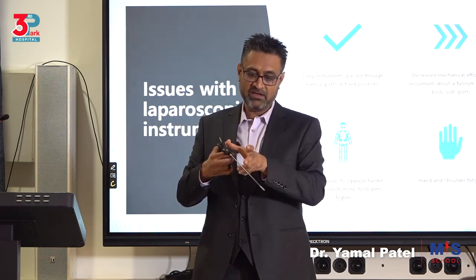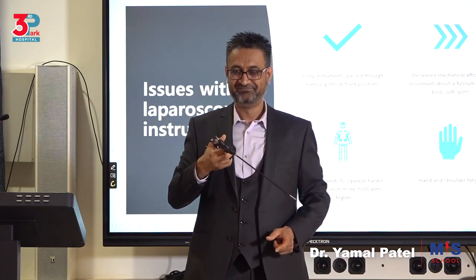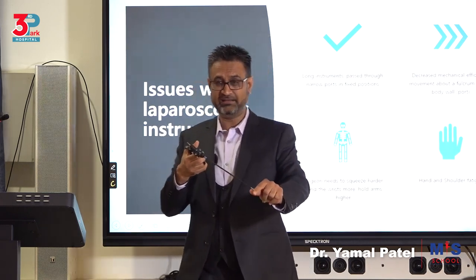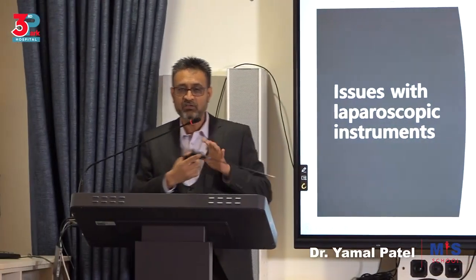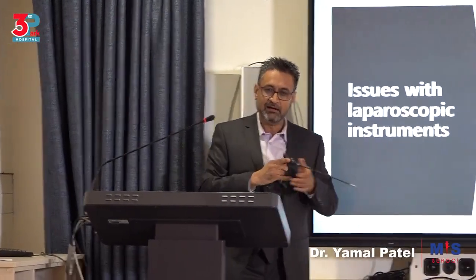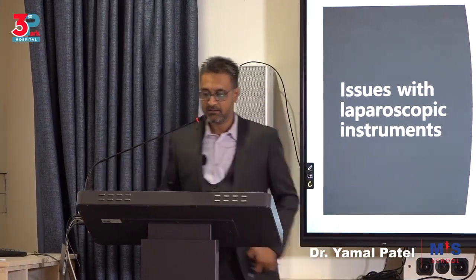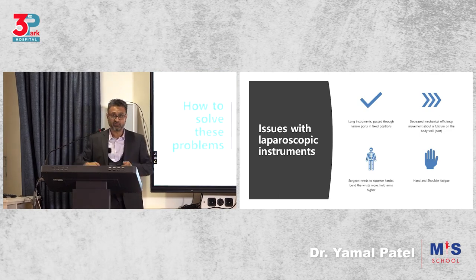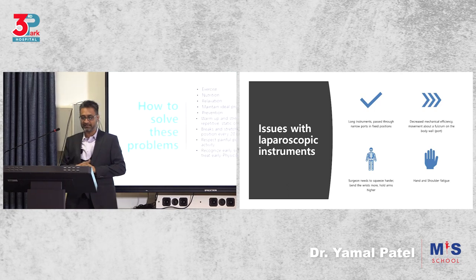In laparoscopy, you'll have to put 3 pressure here to get 1 pressure here. You'll have to put more pressure here to get the same pressure on this. You understanding? So it's not the best scenario. So you have to be careful with how much pressure you put so that you don't injure your hands. Then hand and shoulder fatigue, the way I told you, because of our ergonomics. So we have to remember that's a problem.